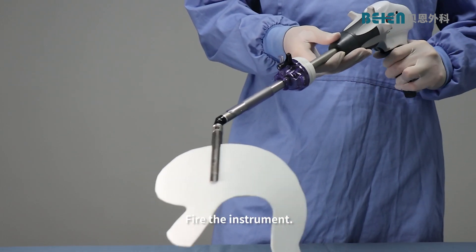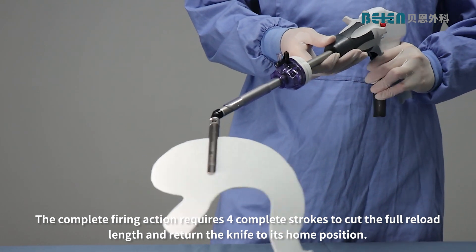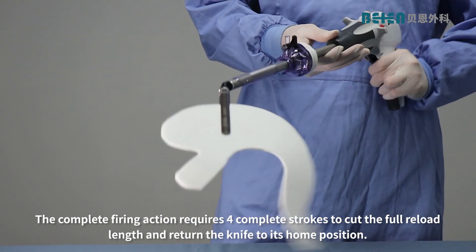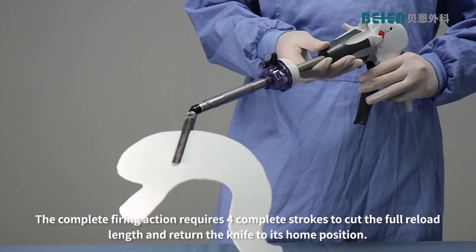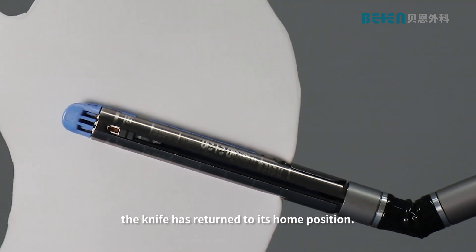Fire the instrument. The complete firing action requires four complete strokes to cut the full reload length and return the knife to its home position. At the end of the fourth stroke, the knife has returned to its home position.